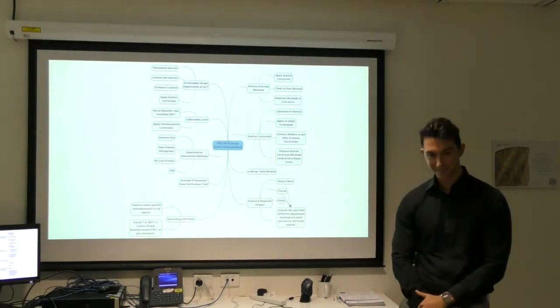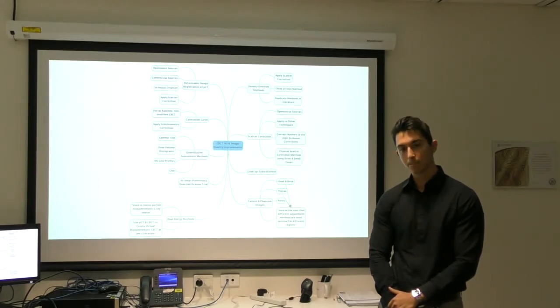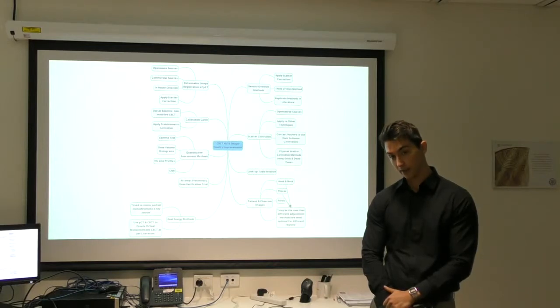Thank you very much for the presentation. I would like to add to that question. You indicated that the CT numbers might be an issue in terms of dose calculation, maybe something that is hampering the development of ART. Is there anything else that you think needs to be resolved from a practical perspective that makes it more acceptable and easier to implement adaptive radiotherapy? Anything else other than the HU? Yes.